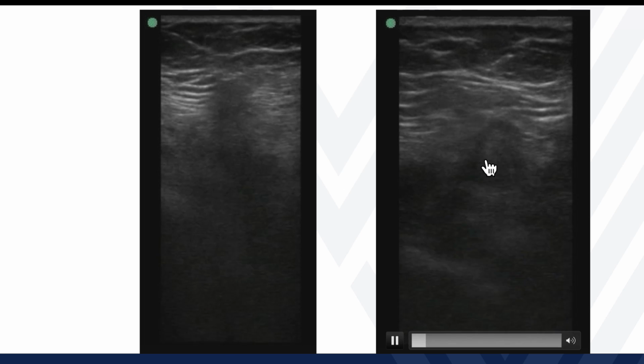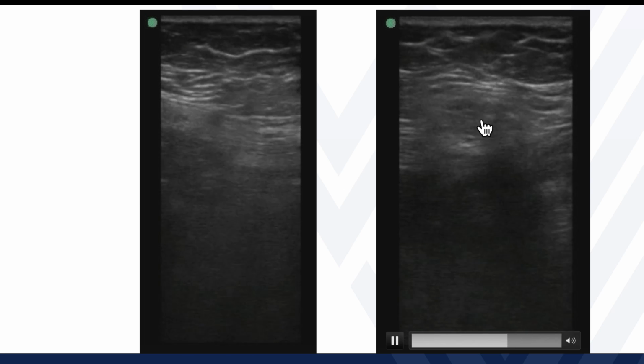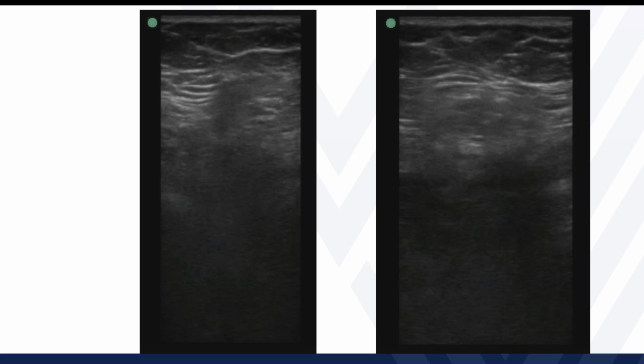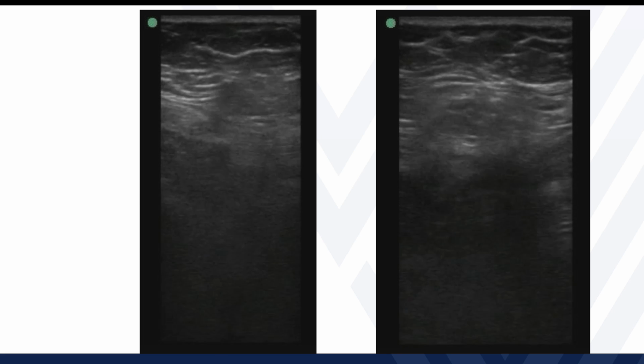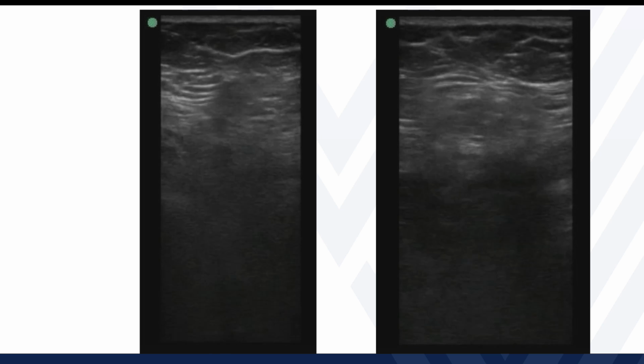This is a little bit of omental fat. This is a fat-containing hernia. I don't know exactly where on the body this is, but the patient says something hurts here. Maybe they feel a lump. Maybe you don't feel it because these can be subtle, but you can look where it hurts with ultrasound and quickly say, yes, I see this hernia, and then help you decide what to do with that.